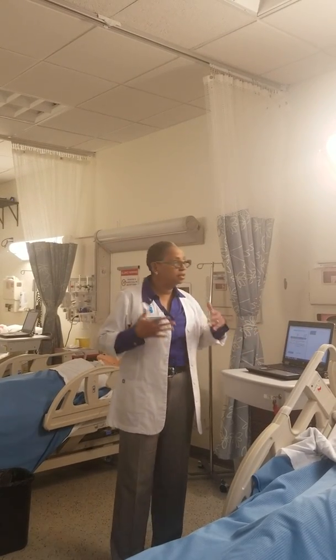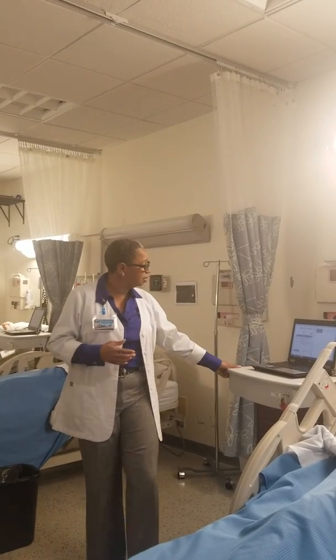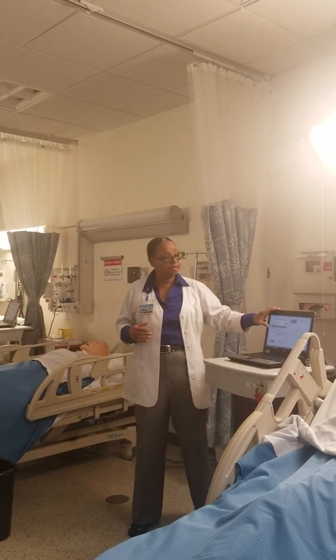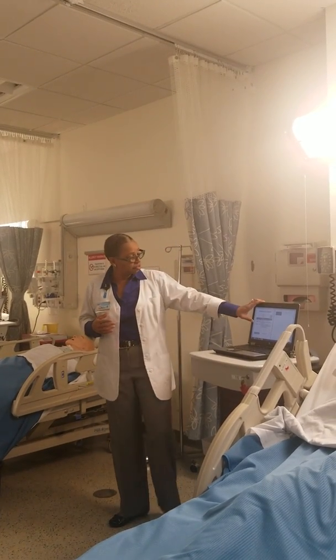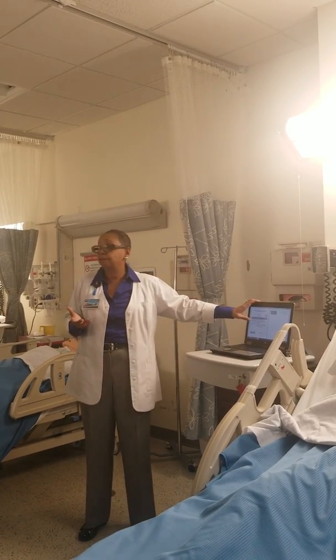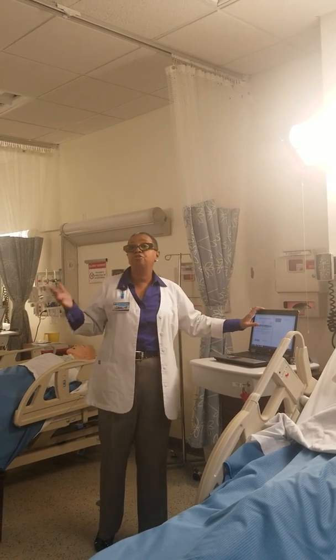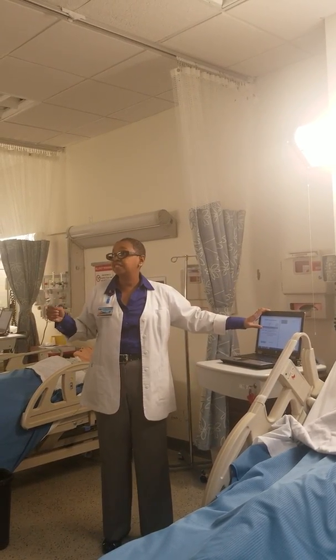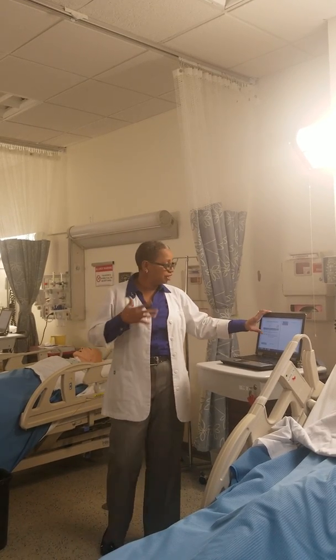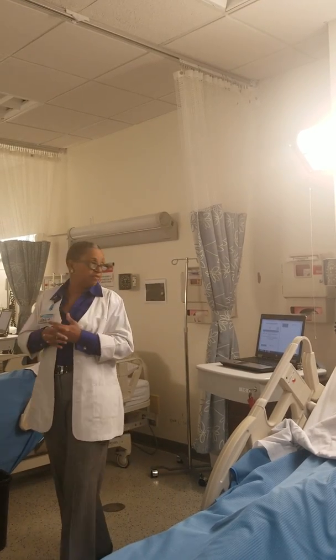When you have a central line, usually hospitals have protocols on who can change them and how often they should be changed. They may just write an order. We do have orders here. They may just write an order, like she has maintained central line placement, okay? Central line dressing, sterile dressing change, Q7 days, or PRN. You may need to change it more often. Sometimes they have a protocol on who changes the line. Does the nurse change the line, or do you have a PICC team or IV access team that comes along and changes the dressing? Definitely notify your healthcare provider if you have signs and symptoms of infection.